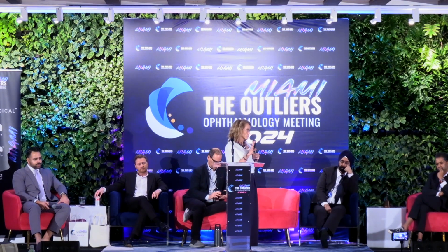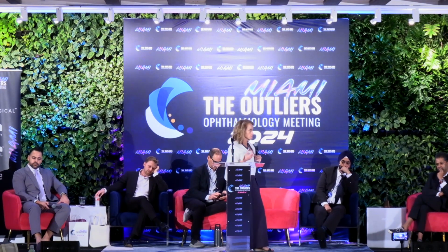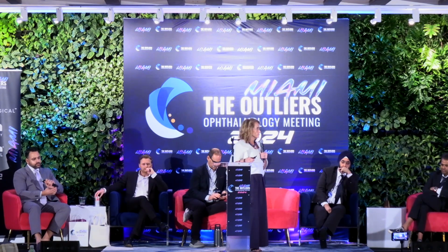So those patients where I don't think that's going to be true, or we just can't get it as good as we would like, that's where a non-diffractive optic might come into play. And if it's really something they can't maintain and it's very hyperosmolar, maybe they shouldn't have any of those fancy optics, and we should just be trying to take care of their cataract and maybe use a monofocal lens.